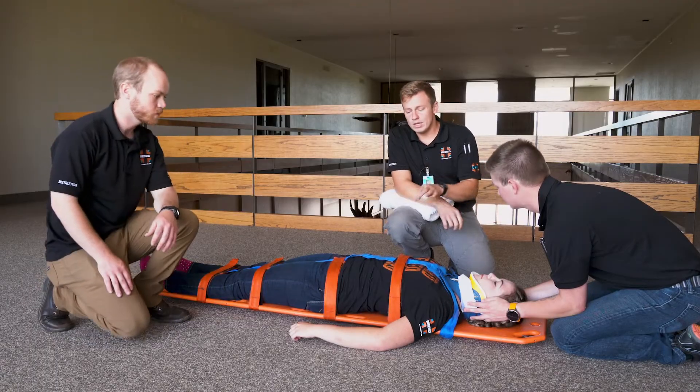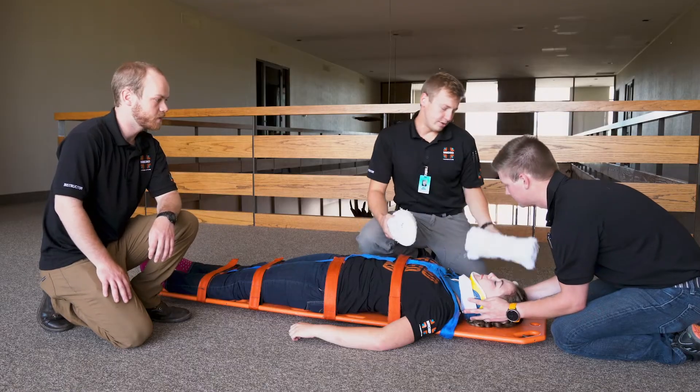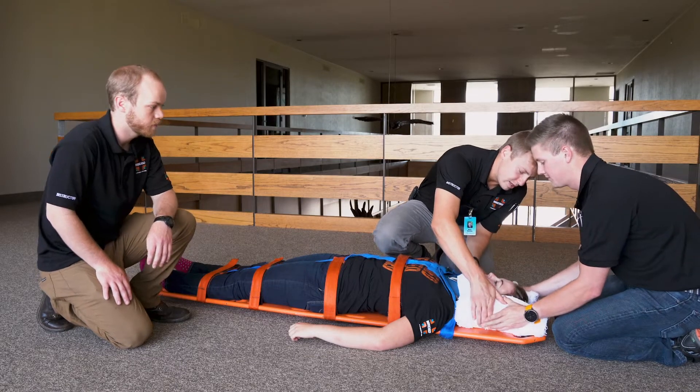Always secure the patient's body to the board before securing the head. I'm going to slide these pads on over your hands. I'll take over manual stabilization while you move your hands out. Okay. Can you take back over? I have stabilization. Back on you.